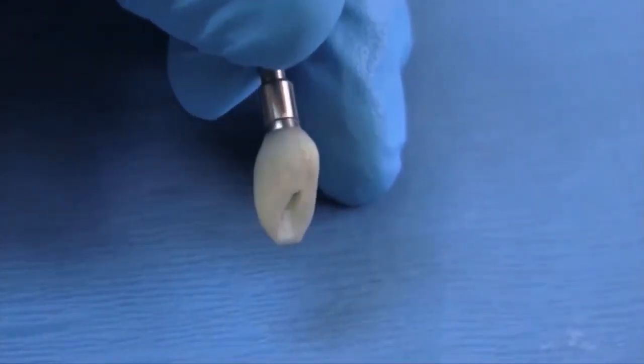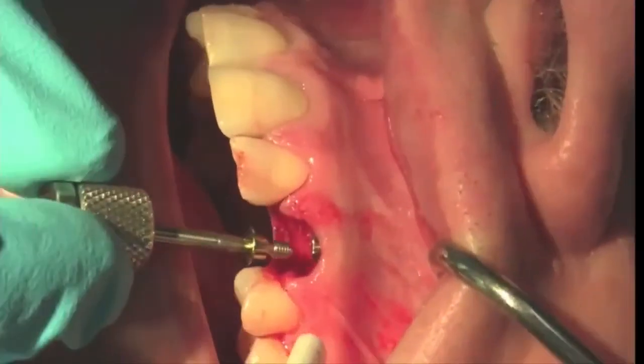So at this point we're getting close to the final design that we want, and this design again is going to have an impact in the perioprosthetic environment. It's going to help us contour our soft tissues. It's going to help us maintain the anatomy, the papillas, the position of the margin, minimizing any kind of impact on the functional and cosmetic requirements to have a good restoration and good soft and hard tissues.